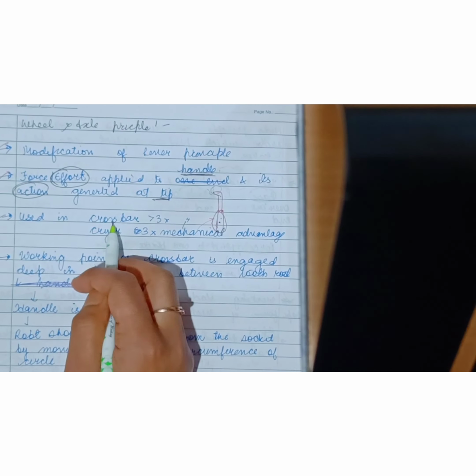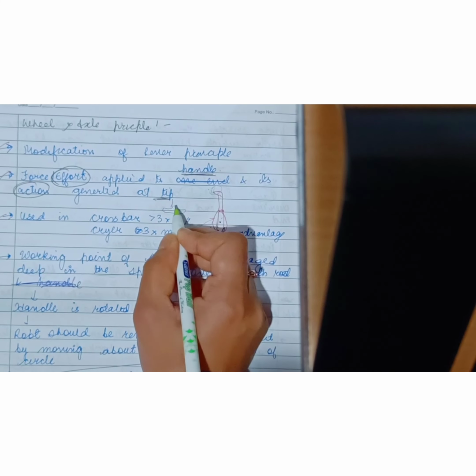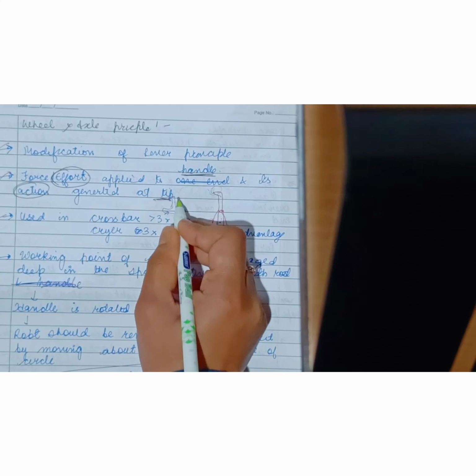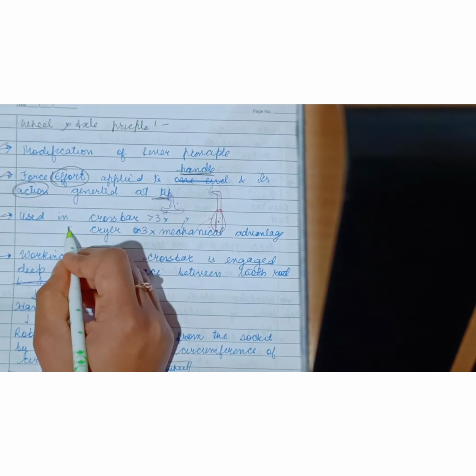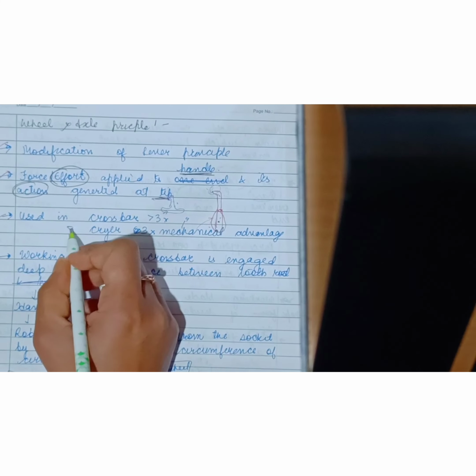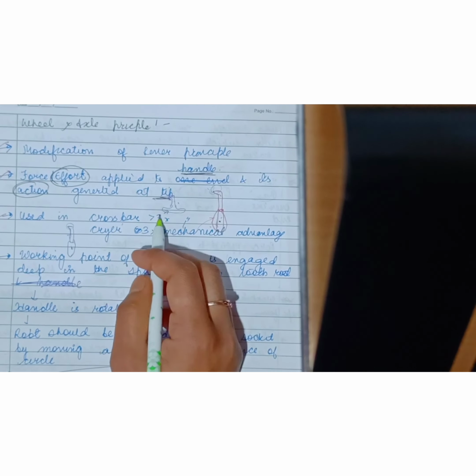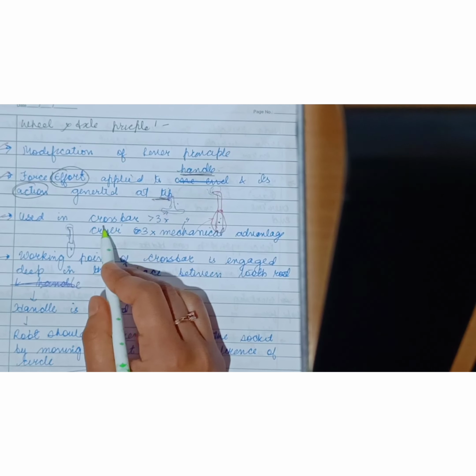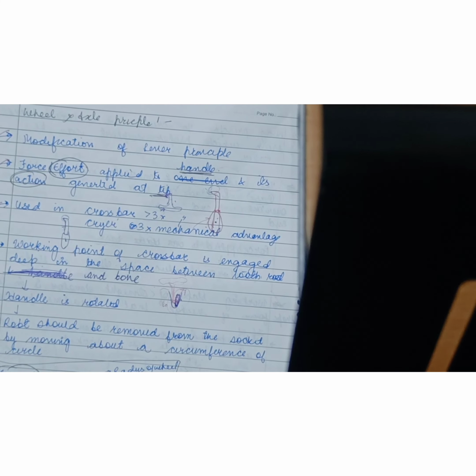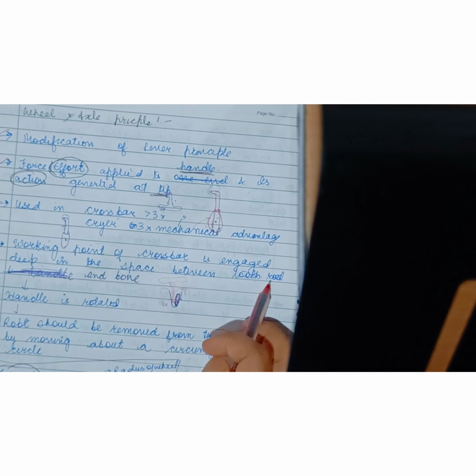This principle is used in crossbar elevators. Crossbar elevators look something like this. Okay. So we apply the force to the handle and the action will be generated at the tip. And Cryer elevators, we know the window Cryer elevators. So force is applied to the handle and the action is generated at the tip. So crossbar elevators, their mechanical advantage is more than 3 times, and Cryer elevators, their mechanical advantage is 3 times, 3x.